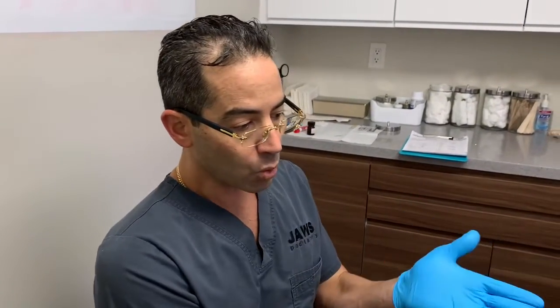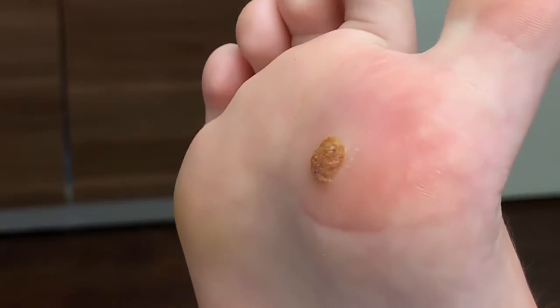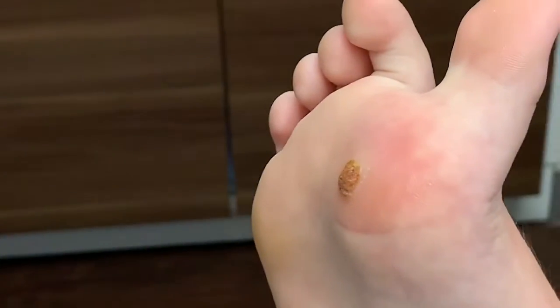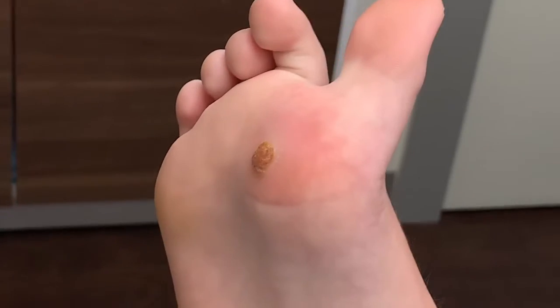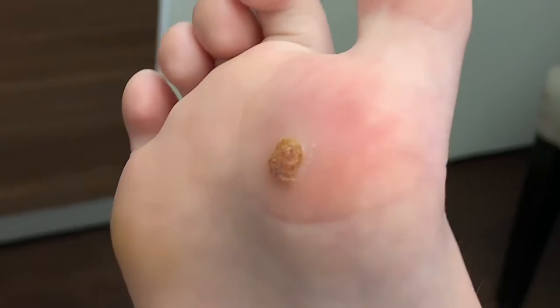So I left a little bit of tissue there. We're going to send the tissue out anytime that we scrape anything out of any type of dermatological manifestation. In this case, we send it out to have it analyzed. Very, very important, okay? We'll let it dry. As everyone can see now, it's turning from brown to white. And that's the reaction, okay? If you wait another 30 seconds, the brown from the beetle juice will turn white, and it's already turning white here. So this is a great case, okay?